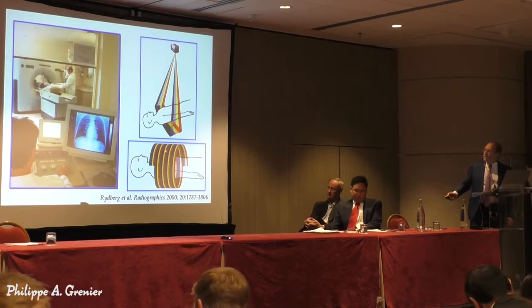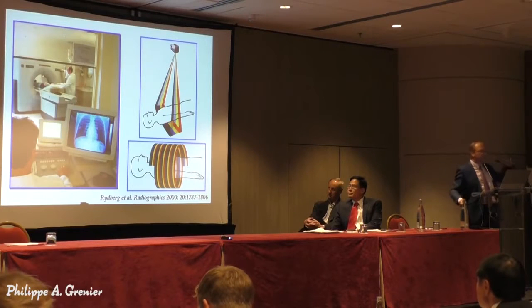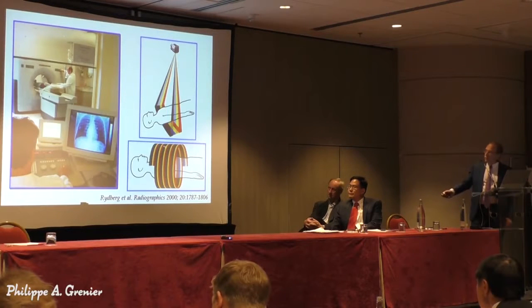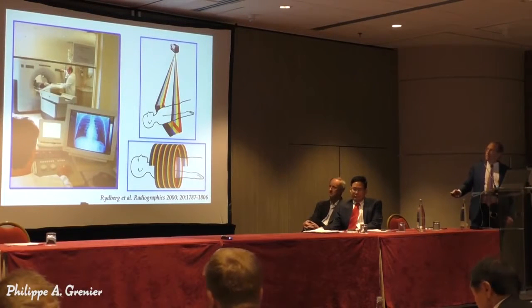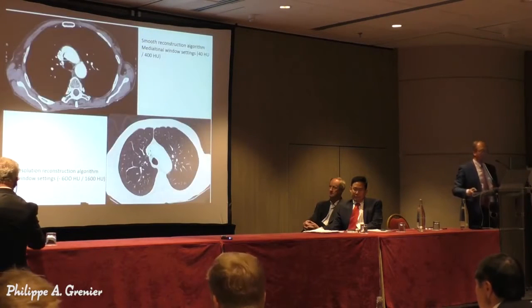And we see here the patient during the CT acquisition when the X-rays are running. The table is moving through the tunnel at a constant speed. So the acquisition is not like this, it's like a helical shape. That's why we call this technique spiral CT or helical CT. And in this way, the images are reconstructed in axial planes, like this.